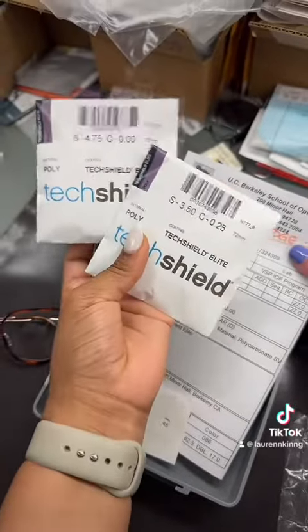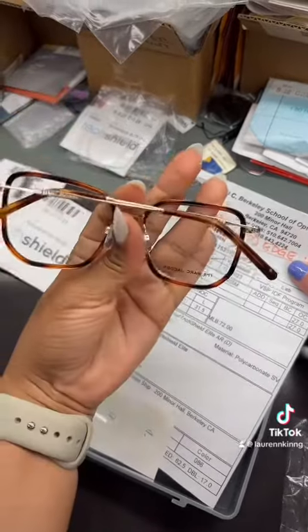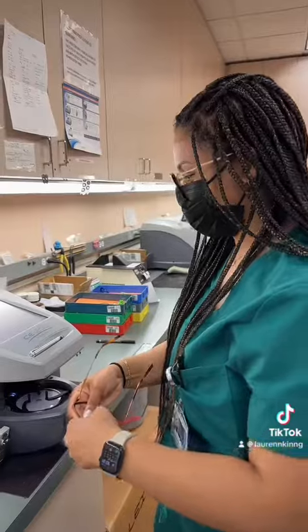First, start by gathering the patient's lenses that are designated for the right and left eye. We have the patient's frames and then the important form that tells us all about the frames, the patient's PD, and the materials that are used for the lenses.